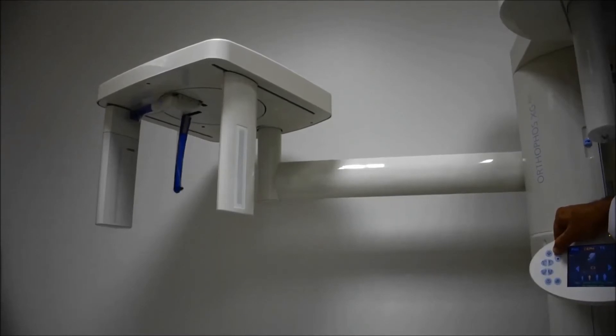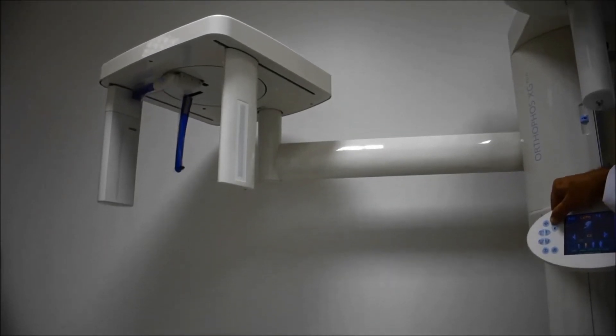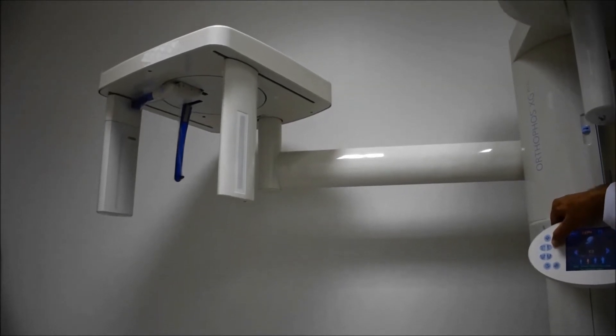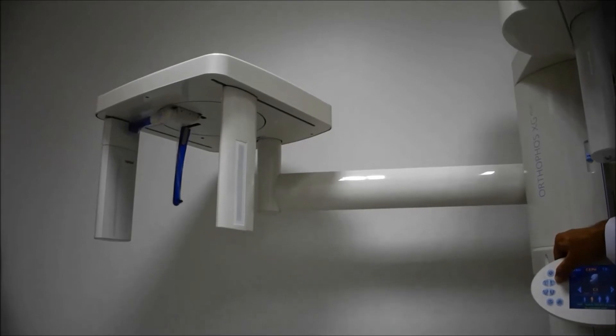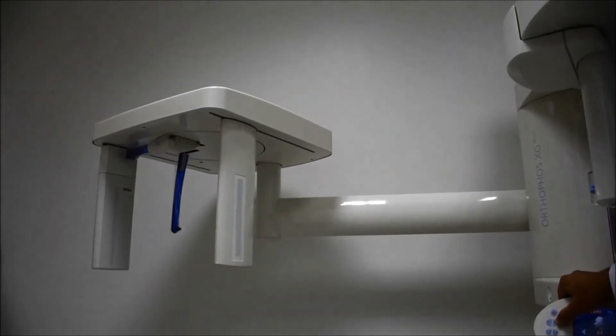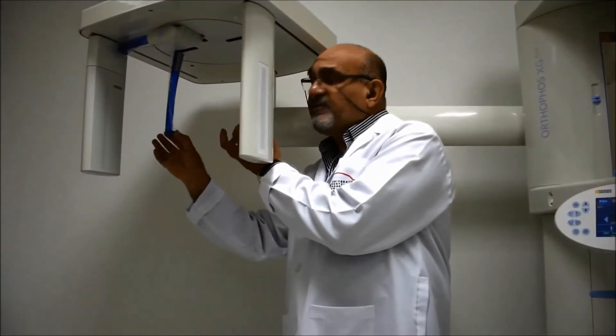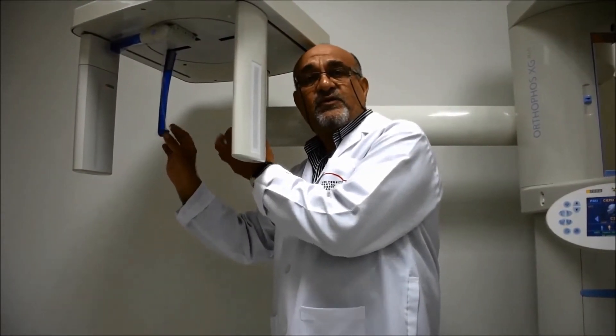You adjust the height of the machine using the up and down arrows so that when the patient is positioned, the ear olives will be at the same height as the patient's ears. This ensures the patient cannot rotate either right or left.